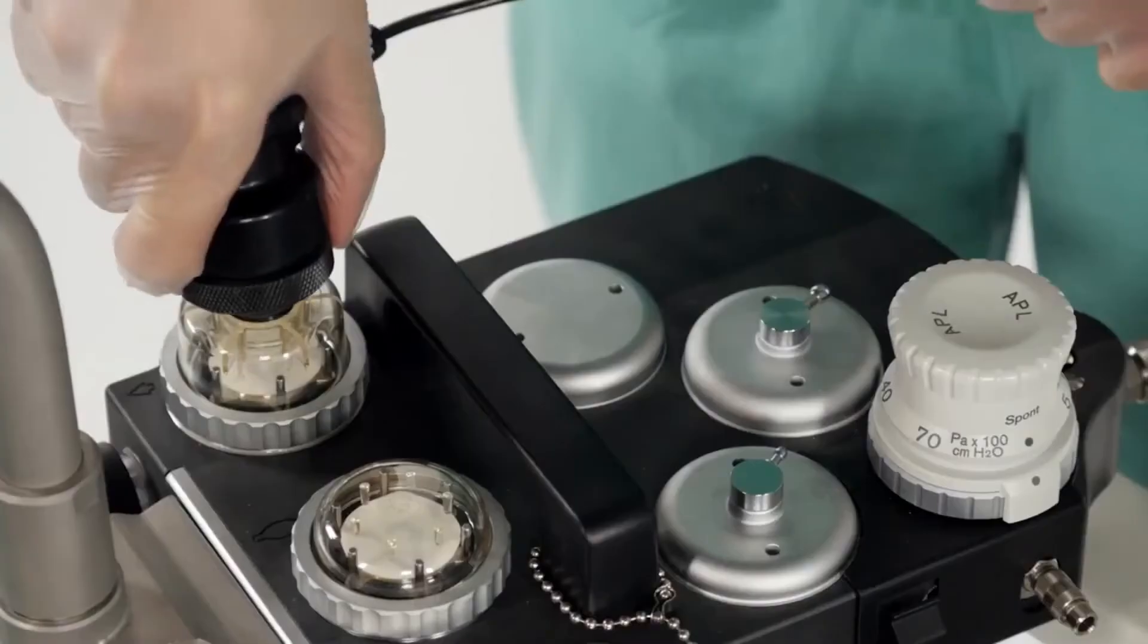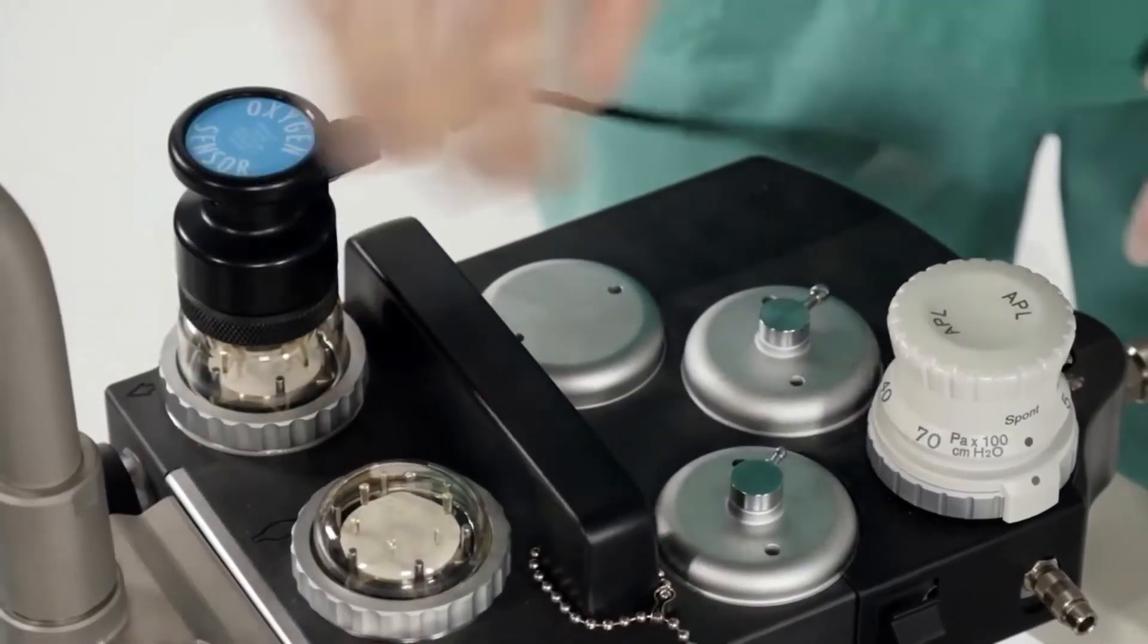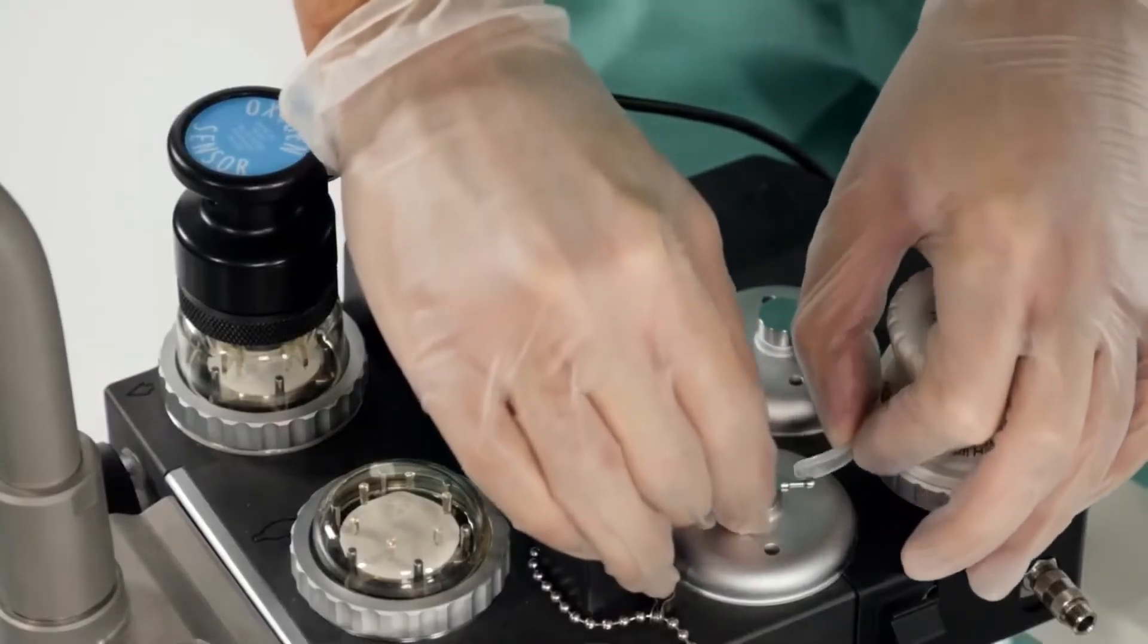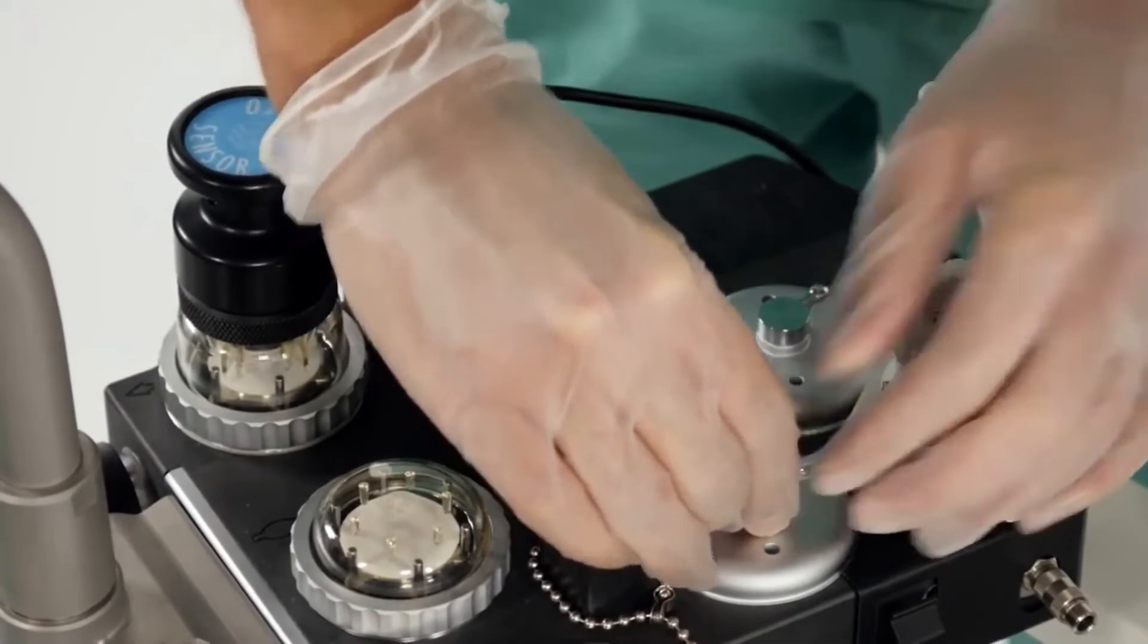Push the oxygen sensor into the opening of the inspiratory port. Plug the control hoses into the connection port on the PEEP PMAX valve and APL bypass valve.